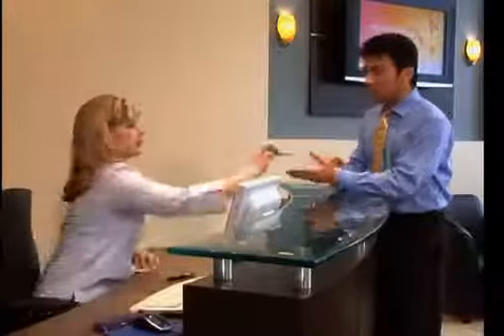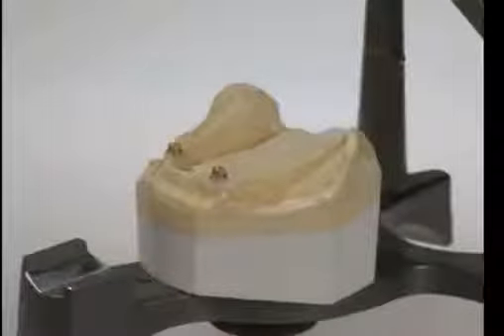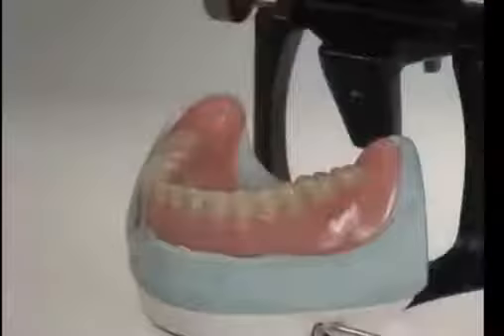The next phase starts with a series of appointments to fabricate your permanent denture. If your gums were stitched closed, we will gently expose the implants. Then we generally take impressions and bite registrations. The lab uses these materials to make an accurate model of your mouth. They'll use the model to create a denture that precisely fits the implants and your bite.